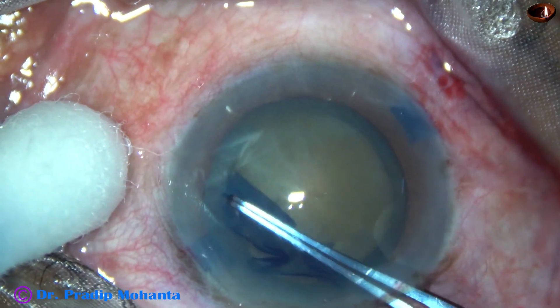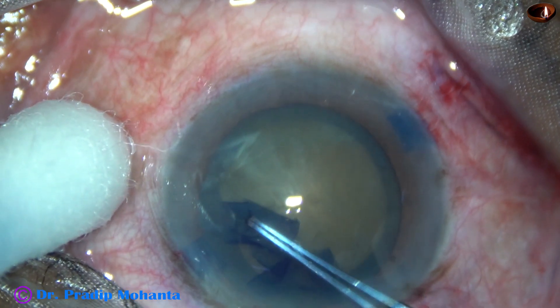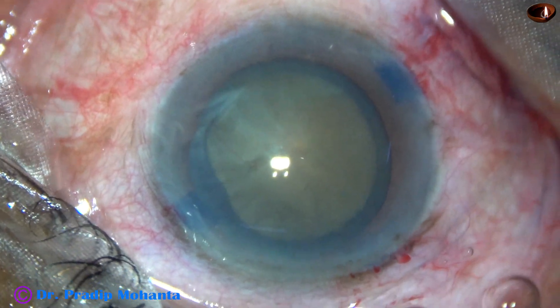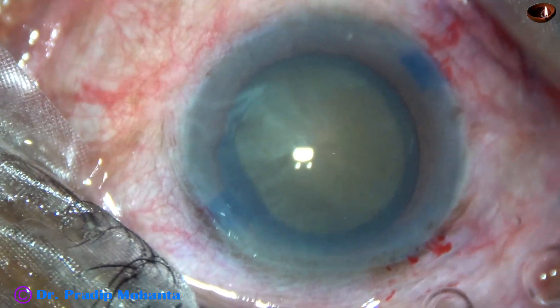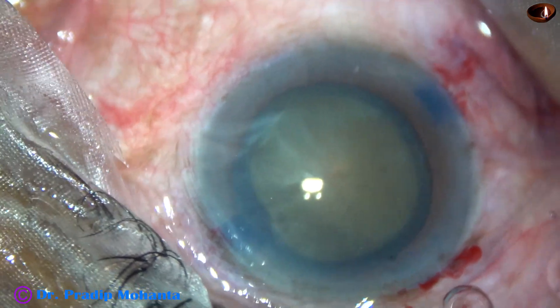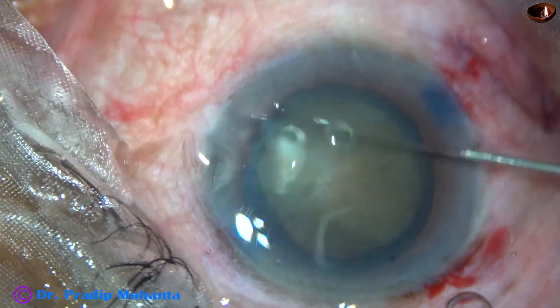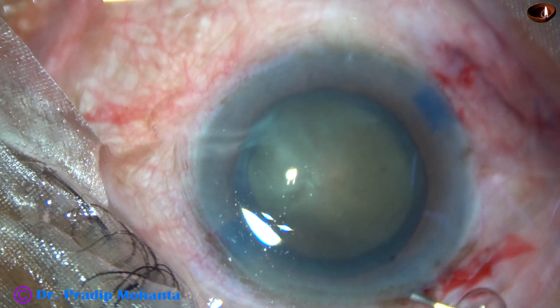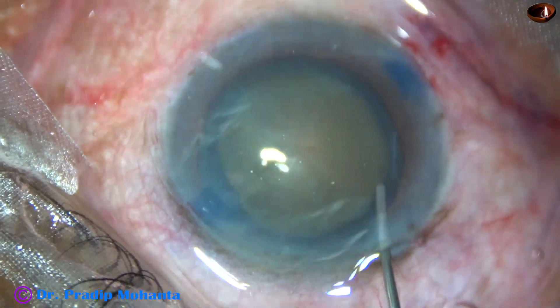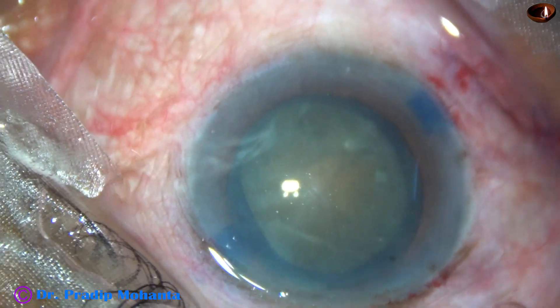At 3 o'clock, see what happens — it tends to go to the periphery. So here, in a very controlled way, the rhexis was brought back on track. We have got a D-shaped rhexis, but it is of adequate size. The rhexis need not always be circular. With this type of rhexis, the intraocular lens will be nicely centered because the haptics are in the equator.